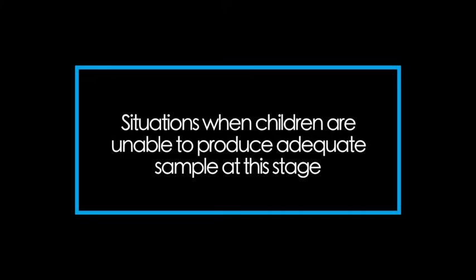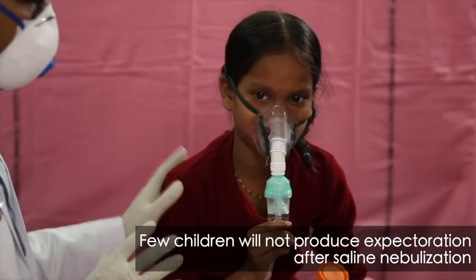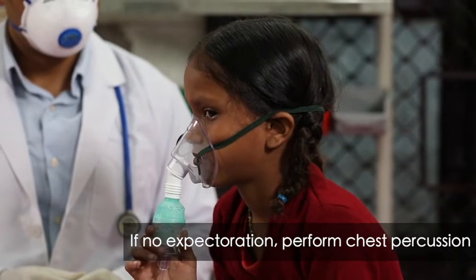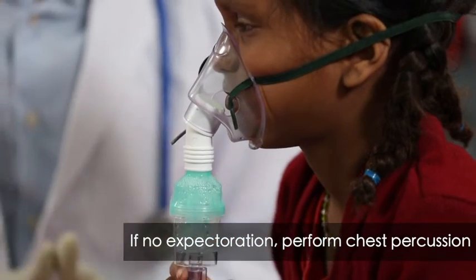Few children will only produce or bring up saliva or no expectoration on their own after 3% hypertonic saline nebulization. In such situations, one can loosen up secretions and assist child in secreting sputum by chest percussion. The purpose of chest percussion is to bring the secretions from the peripheral to central airways, from where the child can cough out the secretions.